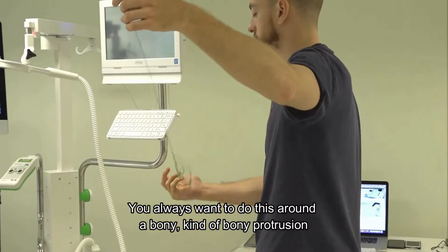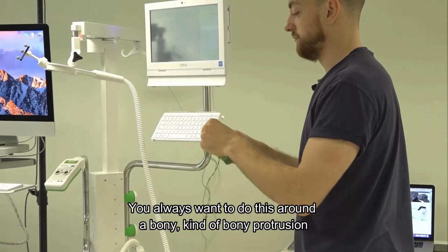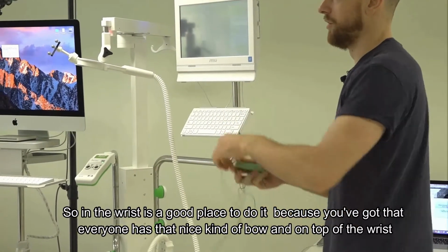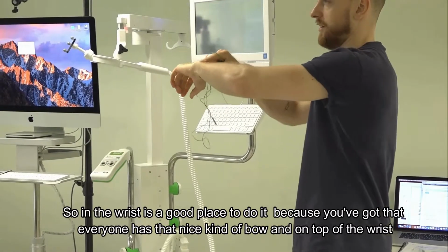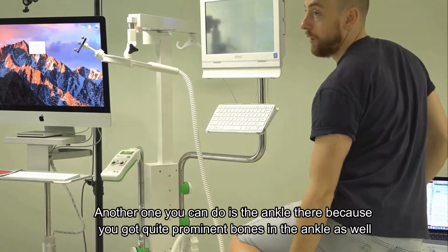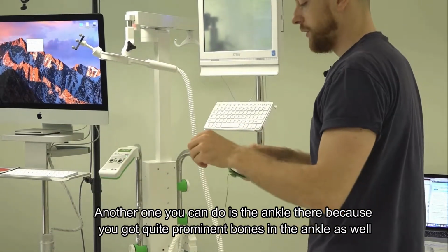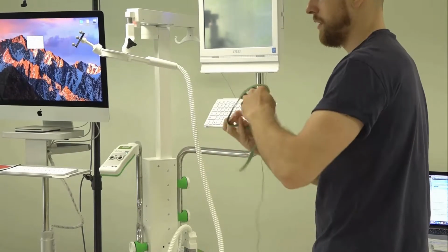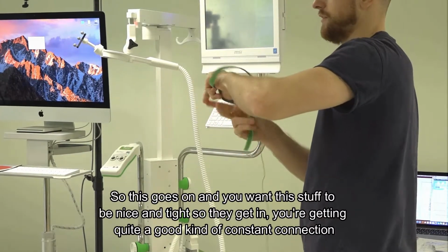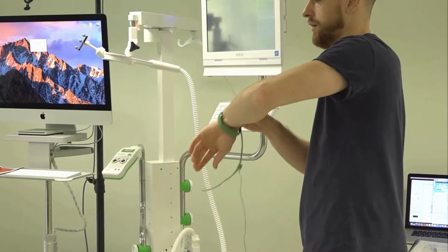You always want to do this around a bony protrusion. The wrist is a good place to do it because everyone has that nice bone on top of the wrist. Another one you can do is the ankle because you've got quite prominent bones there as well. This goes on, and you want this strap to be nice and tight, so you're getting a good, constant connection.